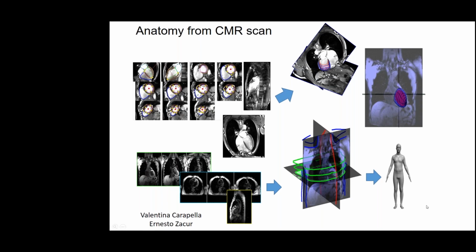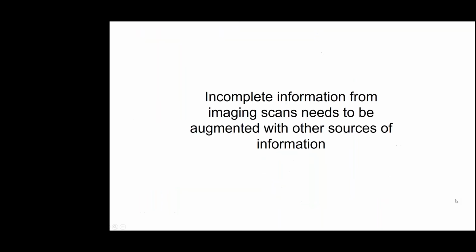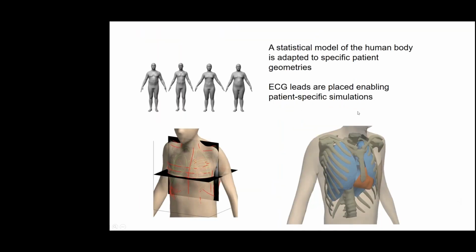So what we need is to start with a representation of a human body that is parameterized, and then find the parameters within that distribution that best fit the contours for that specific person. So what we need is a statistical model. And this is what we have here, right? This is the statistical model in which we are changing one of the parameters, and changing one parameter might make a patient taller or shorter or thicker, or a number of things can change, right? Or even changing, like, the position.